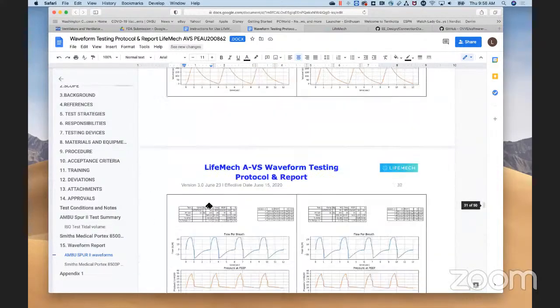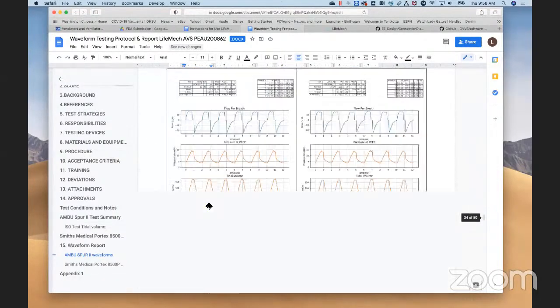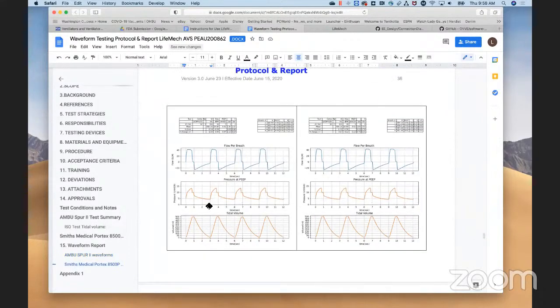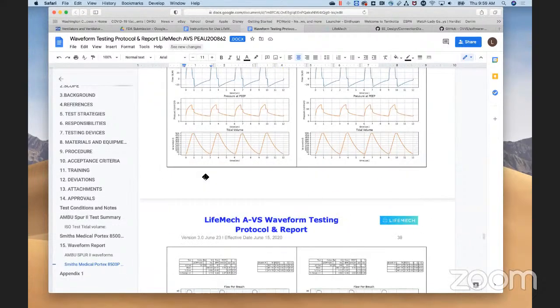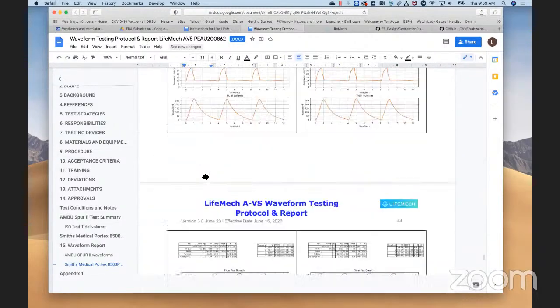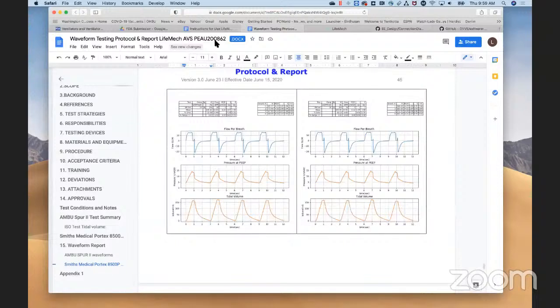There was also another test report, another test that we had to do, which is to keep the ventilator running for a long period of time to ensure that nothing breaks. Pre-testing with the suite, then running for 24 hours, and then post-testing with the suite to show fatigue of the ambu bag, variation of the system over a prolonged operation, and so forth. Sure.